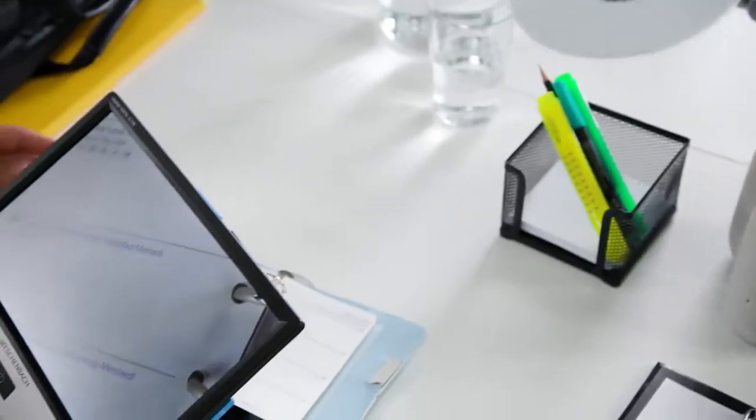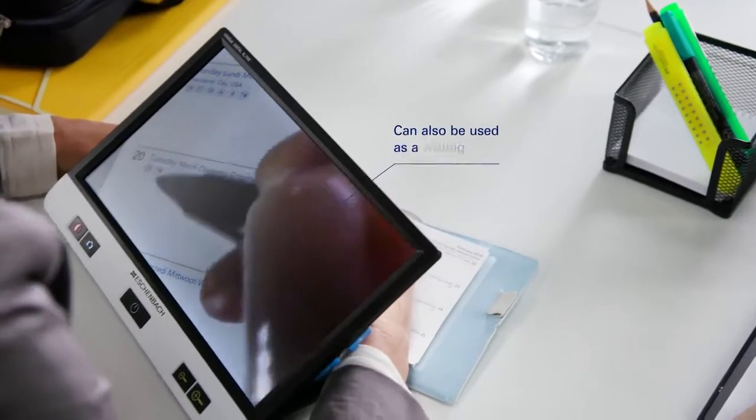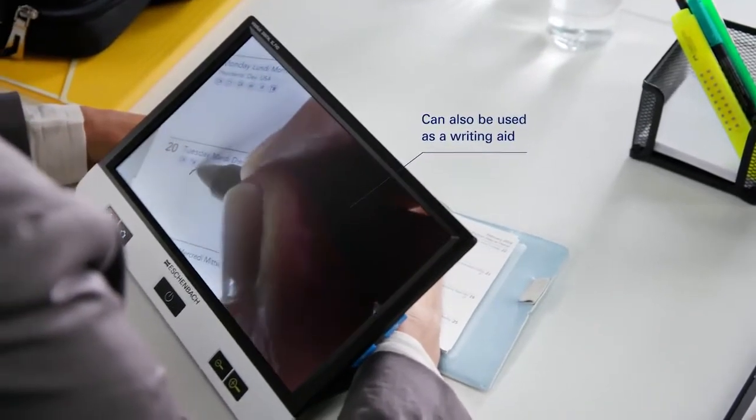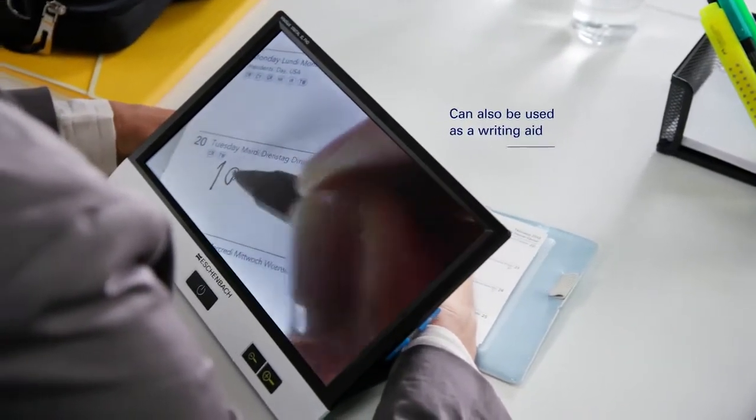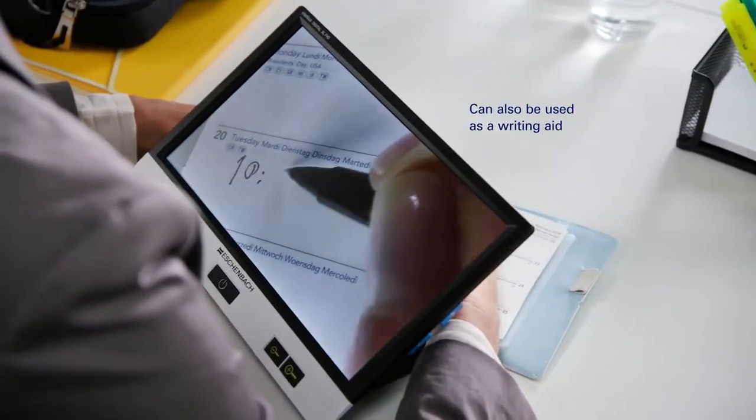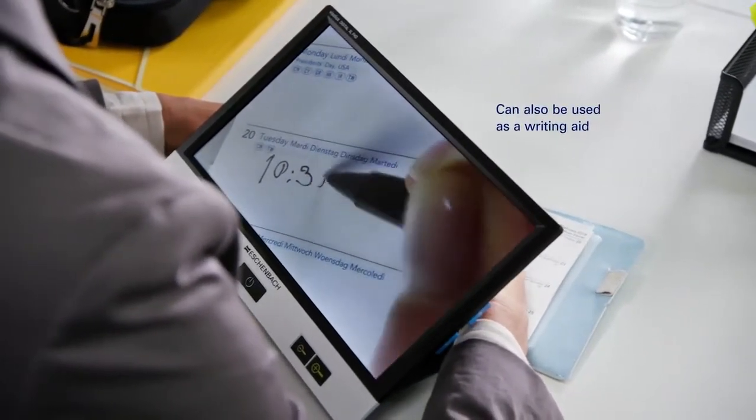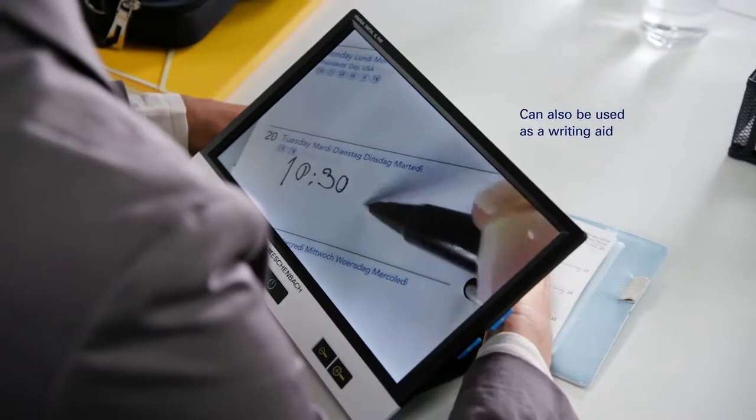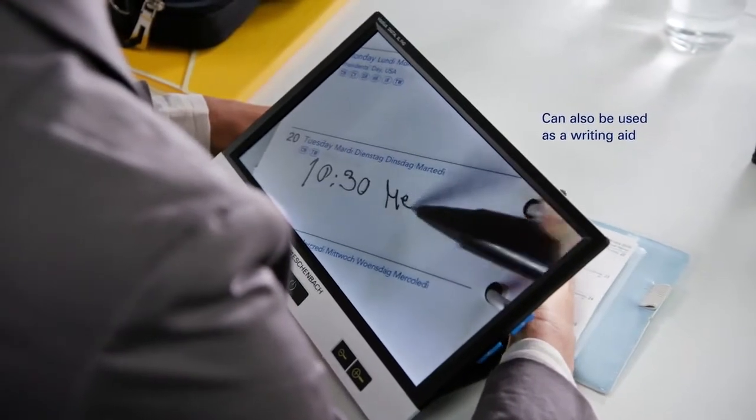The Visolux Digital XL FHD not only helps you with reading, but thanks to the open shape of the stand, you can also write beneath it.